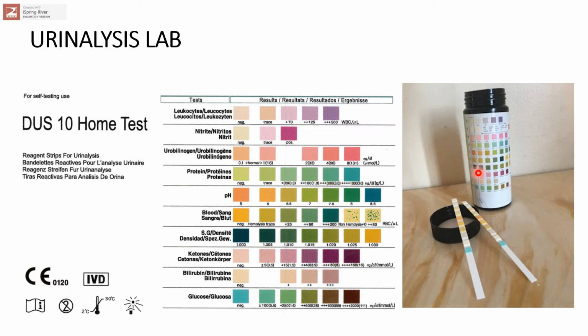So this bottle is actually available over the counter in Walgreens or CVS, so they're very easily available. The professional kits are slightly different if you're testing for things like ketone.